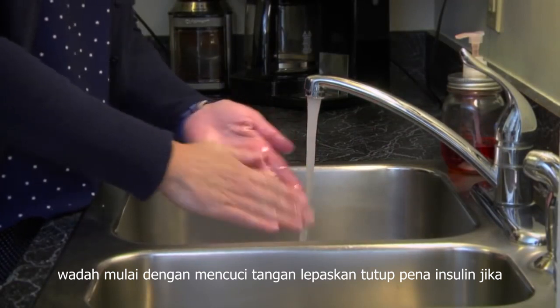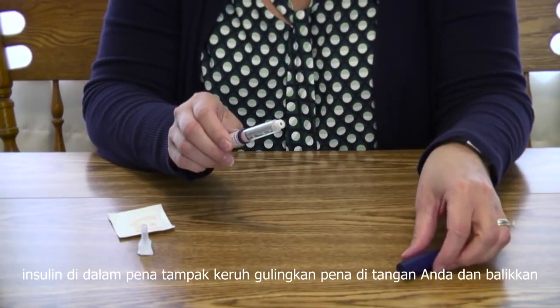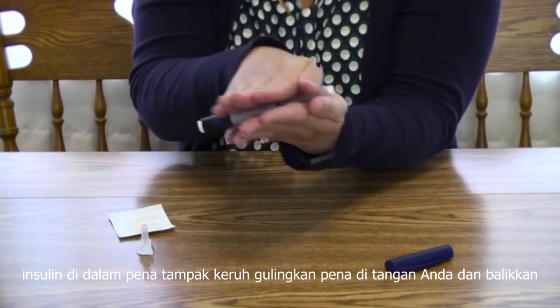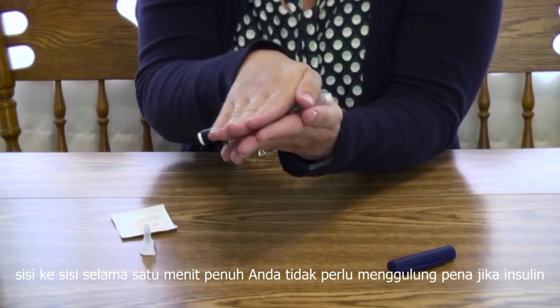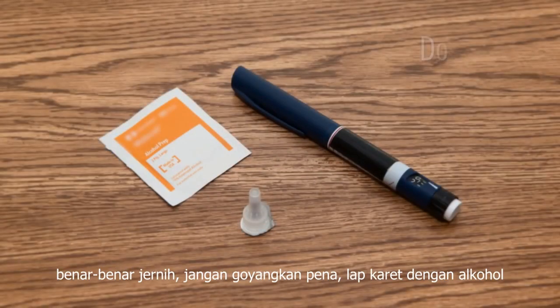Begin by washing your hands. Remove the cap of the insulin pen. If the insulin in the pen appears cloudy, roll the pen in your hands and turn it from side to side for 1 full minute. You do not have to roll the pen if the insulin is completely clear. Do not shake the pen.